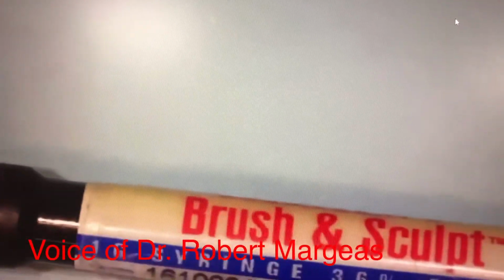Now, these are what I was talking about. Here's Brush and Sculpt from Cosmedent. You have resin blend here. And the wetting resin from either Bisco or Ultradent, very, very nice materials. There's a difference in the filler content, okay? So I put the brush into the wetting agent, and then what I do is I prime it.